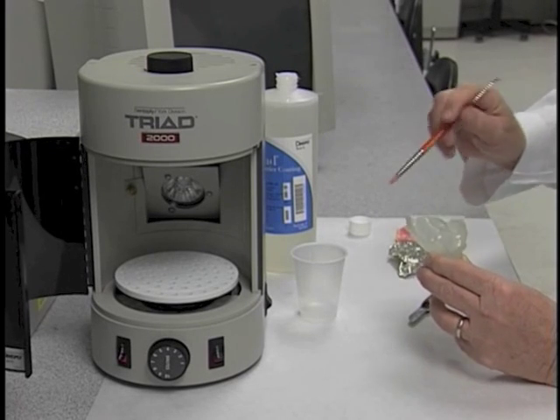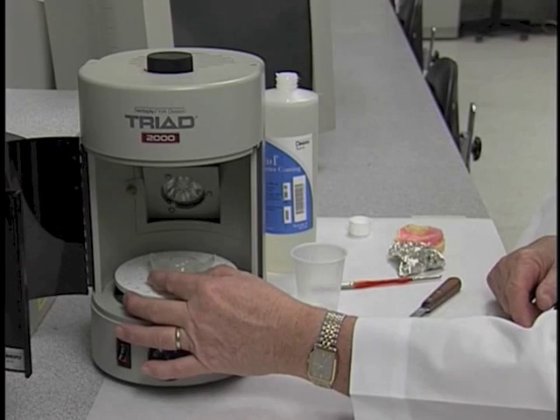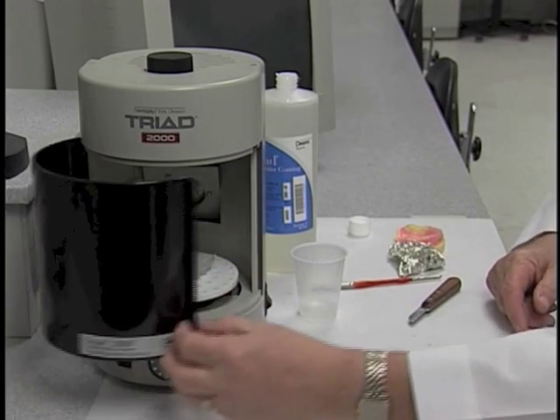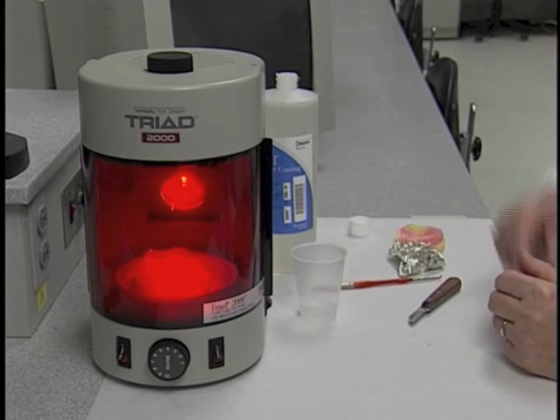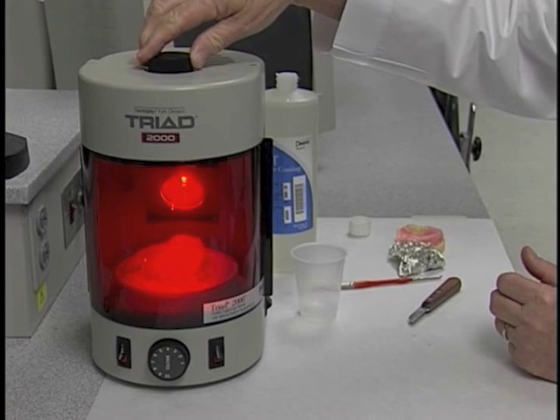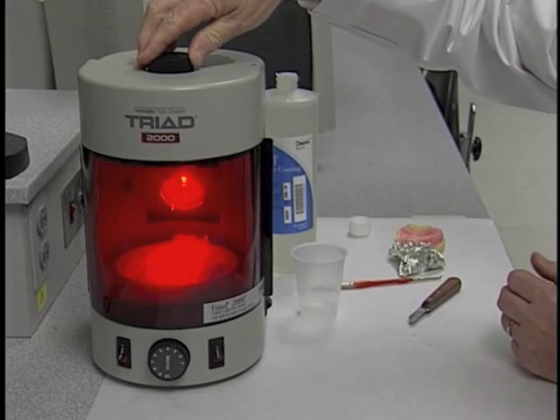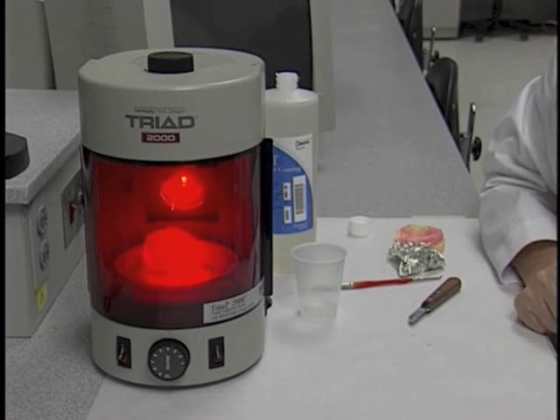And once we've done that, we're going to place it back into the oven and cure it again for 4 minutes. And since the cast is not there, I'm going to raise that table just a little more, about like that, so that we get a maximum concentration of the light onto the material.